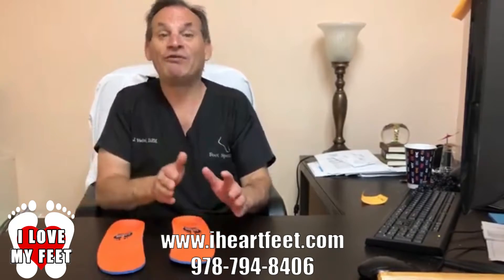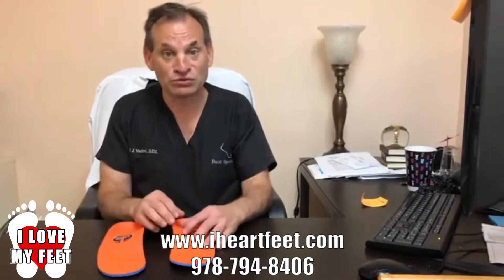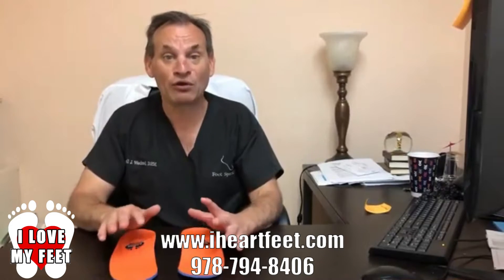Just so you know, we have another product line made for dress shoes, so they're not as big and bulky, but will fit into all dress shoes whether you're a man or a woman.